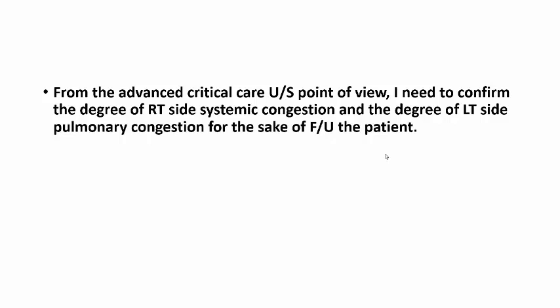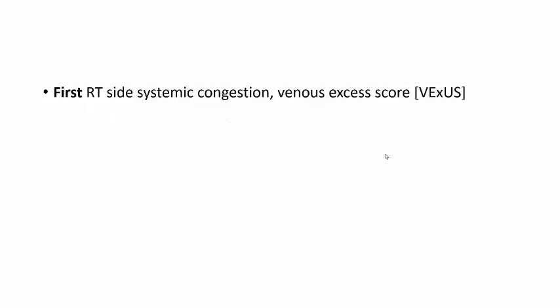Is there any right side increase in pressure, and if so, is this pressure affecting the systemic circulation, leading to systemic organ congestion? This is very important to follow up your patient.